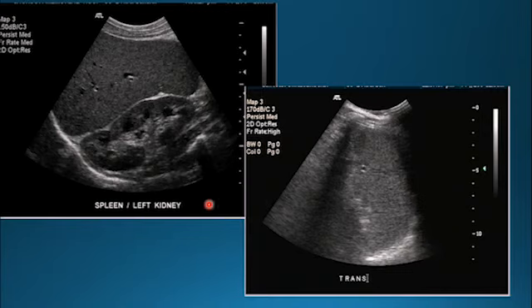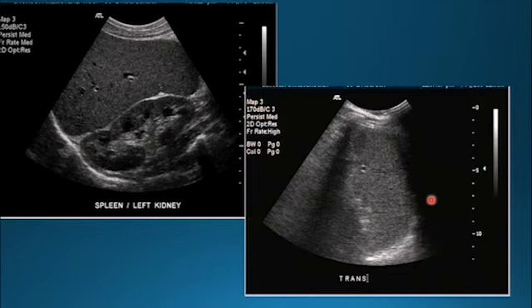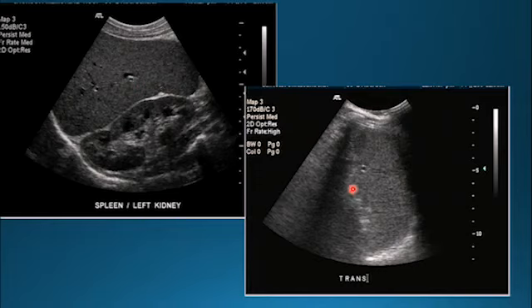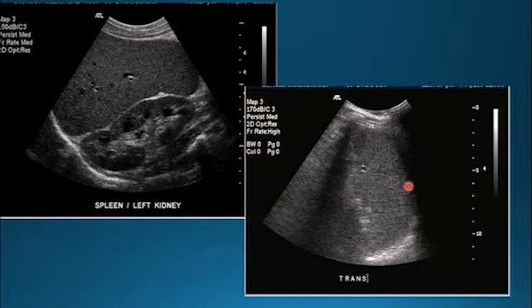Here's an example of two images of the spleen — the sagittal coronal axis and the transverse. You would measure from superior to inferior along this axis of the spleen, and then your transverse from the hilum to the back border of the spleen at the diaphragm.